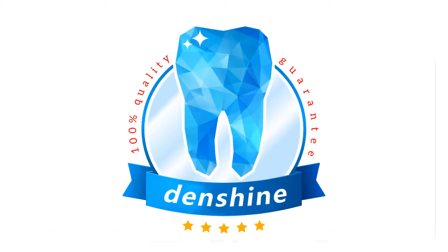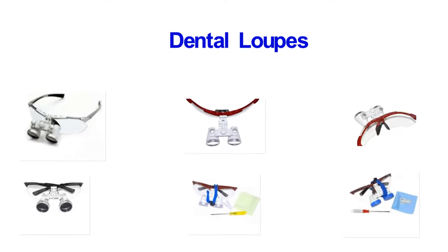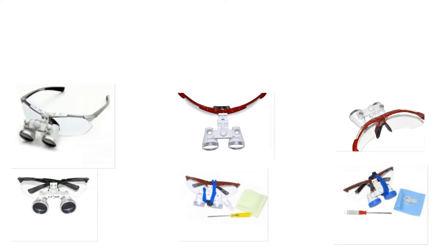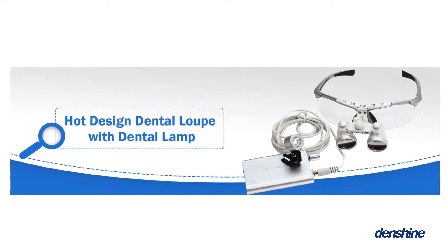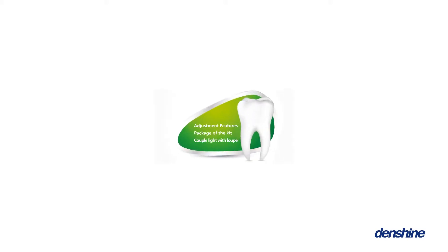Hi, this is Denshan online. Today we'd like to show you one of our Denshan dental loupes. In this video, I will show you the instructions for it. The loupe plays an important role in surgery, so Denshan is dedicated to provide a new loupe for you. Now I will introduce it from the following points.